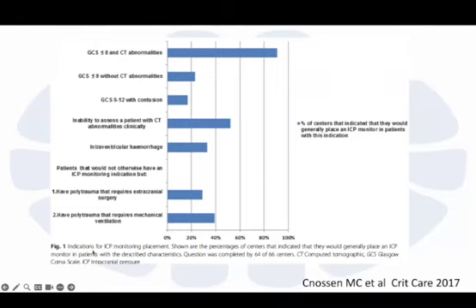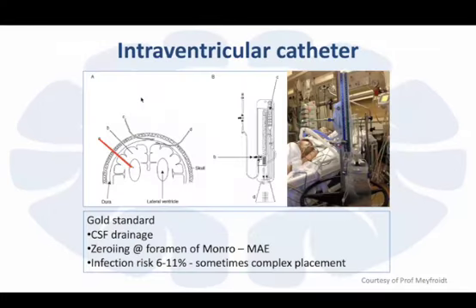Or think about all the situations where you have, for example, a patient with traumatic brain injury, but also thoracic trauma. And in this situation, the patient maybe is not able to do any clinical evaluation because he needs to be sedated and paralyzed because of a chest trauma. Here, probably ICP can be used even if the GCS is not below 9. So there is a lot of variability and a lot of confusion also regarding the indications.